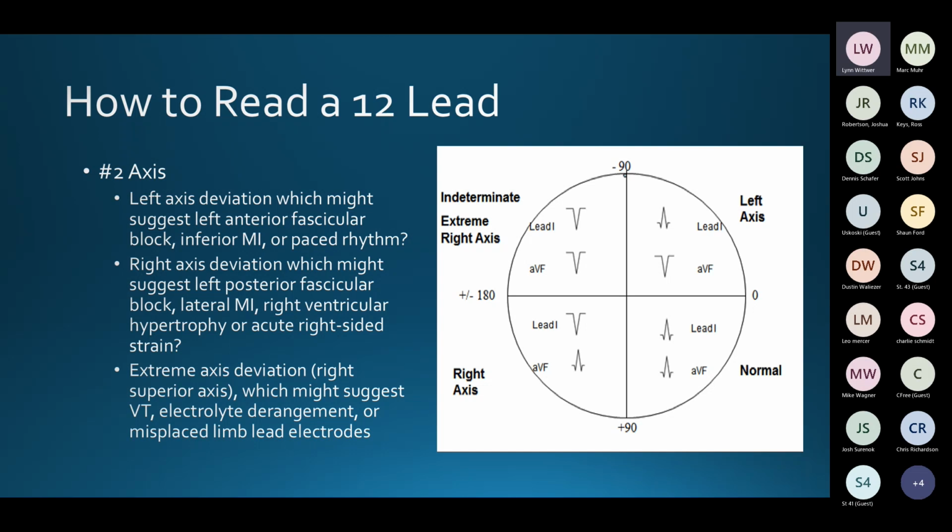You know, the 12 lead, it's like a camera and it's looking at the heart in 12 different directions, and an upward deflection always means that the primary electrical vector is coming toward that camera lens or that electrode end. We like to look at this at the heart then in a 360-degree circle. You break the circle up into 4 quadrants.